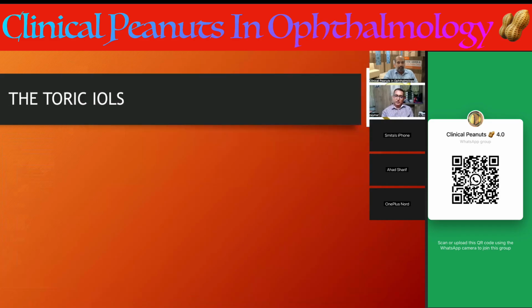So the toric IOL is essentially an astigmatic IOL, wherein with a unique kind of calculation, whatever astigmatism is there on the cornea, we figure out a toric calculation with which we implant the toric in a way that will nullify the effect of the corneal astigmatism. So it is to correct astigmatism.